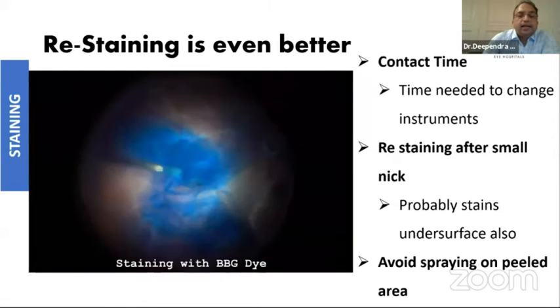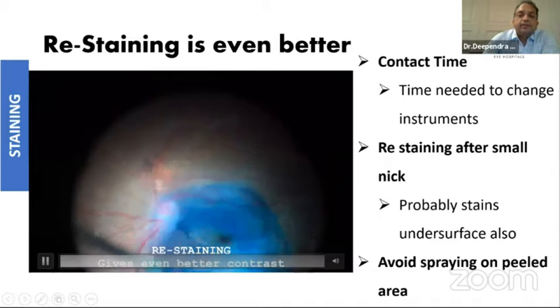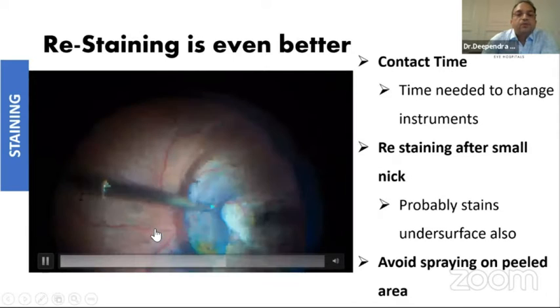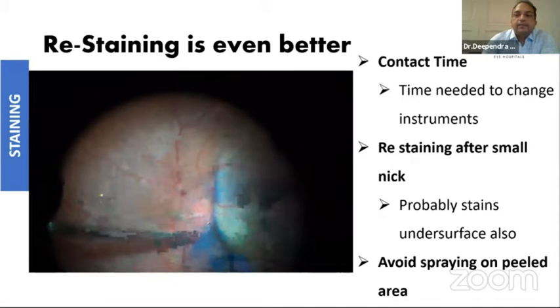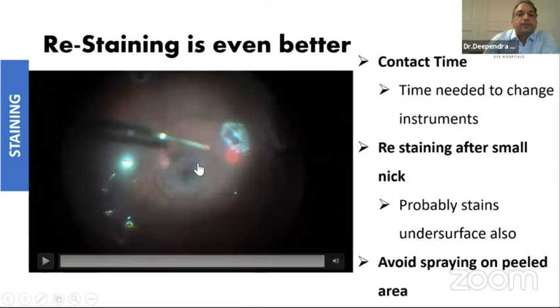The beauty of this BBG dye is that you can restain it, which we were very hesitant to do with ICG. Restaining actually stains the undersurface of the island. If you are not happy with the stain, you can restain. Most people ask how much contact time to allow — the answer is it is almost instantaneous. The moment you inject the dye and take out one instrument and introduce another, that much contact time is good enough for BBG dye.